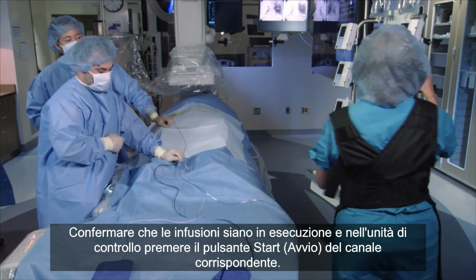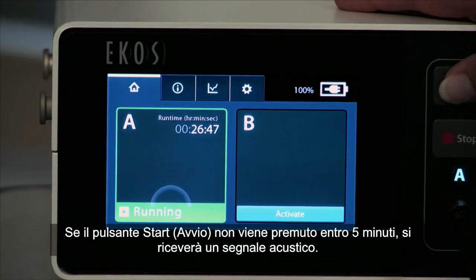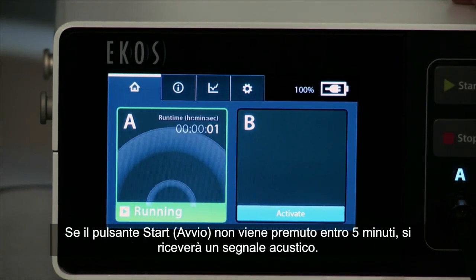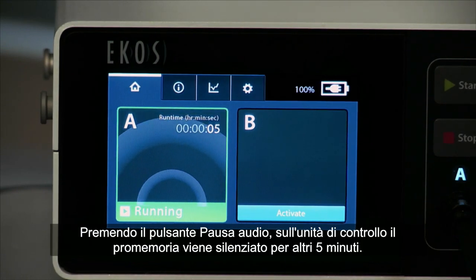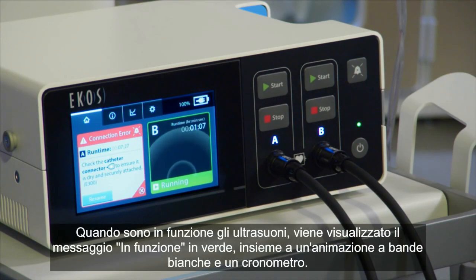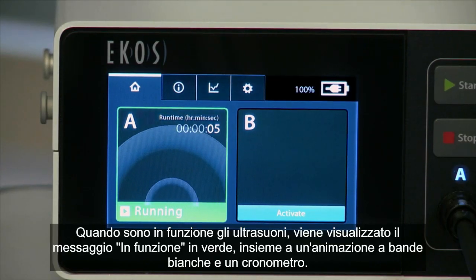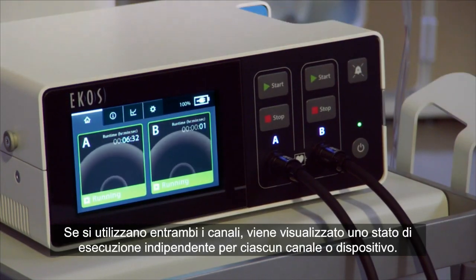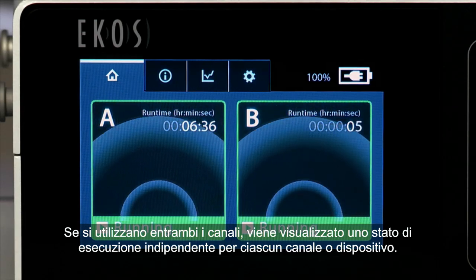Confirm infusions are running and press the Start button on the control unit for the appropriate channel. If the Start button is not pressed within 5 minutes, it will alert you. Pressing the audio pause button on the control unit silences the reminder for an additional 5 minutes. When ultrasound is running, a green running indication is displayed, white bands animate, and a runtime clock counts up. If using both channels, the running status is displayed independently for each channel or device.